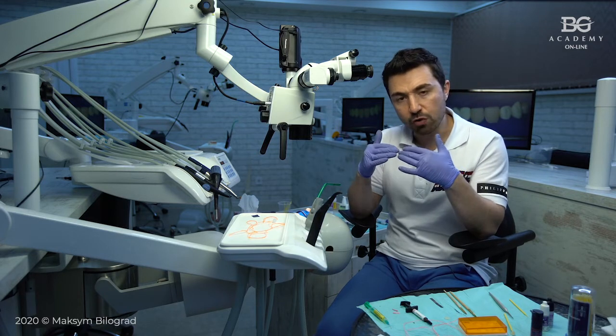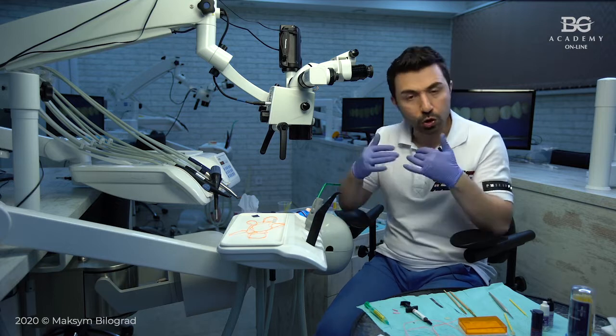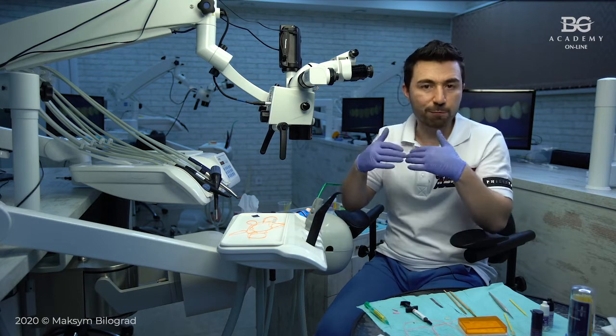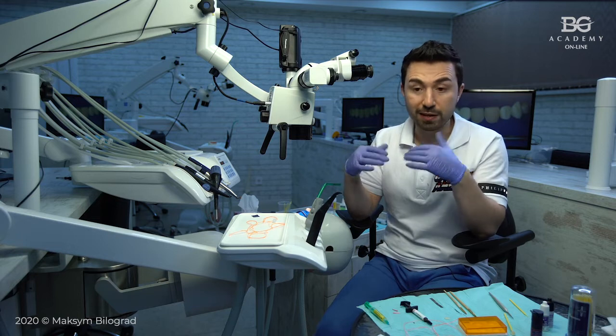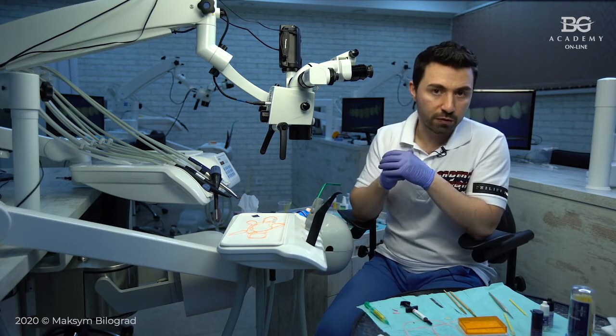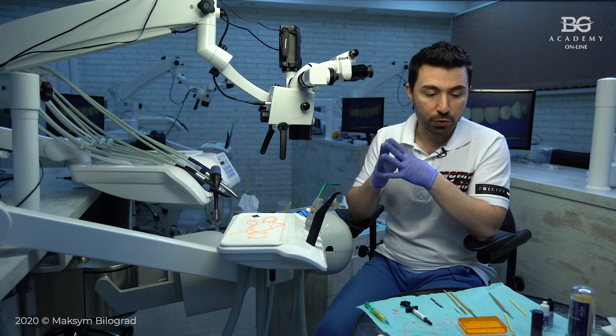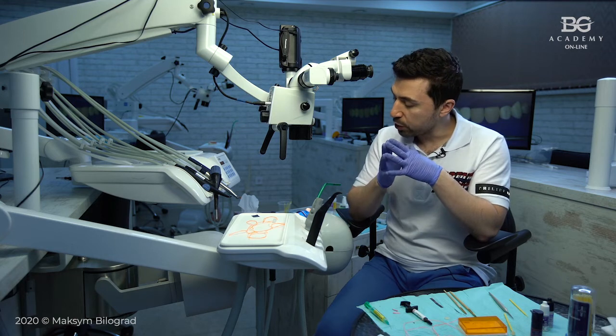In this case, we prep intracervicular, so we localize the finish line within the sulcus, but don't go too deep. Halfway into the sulcus is more than enough, or even 0.2, 0.3 millimeters under the sulcus will give you a good result. Okay, so in this case the isolation will be pretty simple.